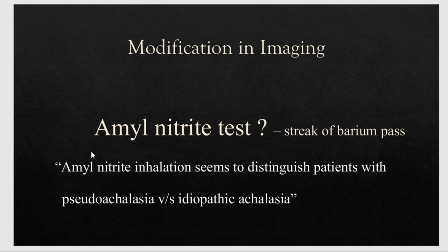Now, what is the amyl nitrite test? Very important. If we give amyl nitrite through inhalation, it helps distinguish patients with pseudoachalasia from idiopathic achalasia. Pseudoachalasia means features of achalasia are there, but it is not true achalasia. It is because of some other disease that the patient presents with features of achalasia.